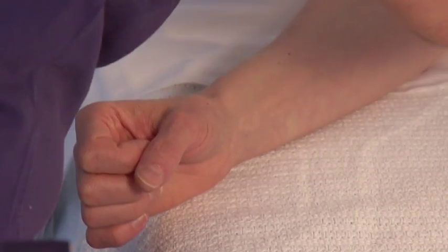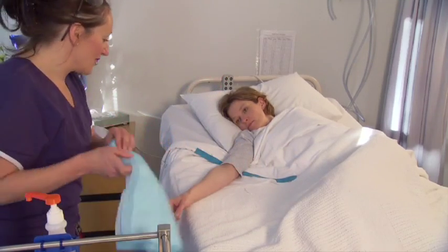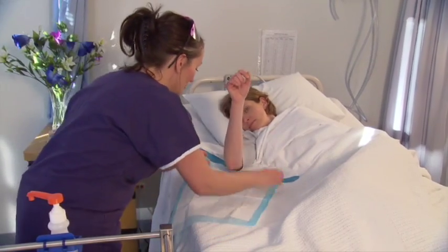All right, I'm just going to release this. The tourniquet should be released until the equipment is ready. And then I'm going to start setting up everything that we need.